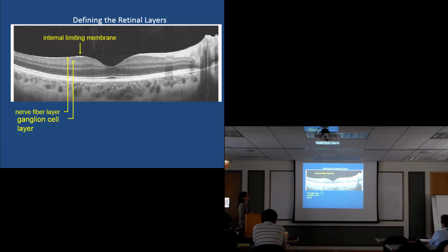For anatomy, this right here is the fovea, obviously, the foveal depression, and that depression helps get the light signal to the photoreceptors without the interference of the overlying layers of the neurosensory retina. And so our most accurate vision is here in the fovea. But this is considered all the macula anatomically, and we look at the structures within the retina and also the choroid now to look for that healthy, thick choroid, which should be about the same dimension as the neurosensory retina in the fovea. So sorry, it's overlapping.